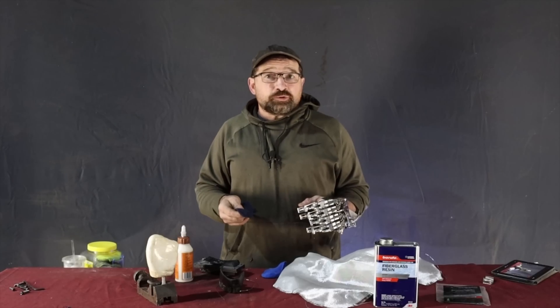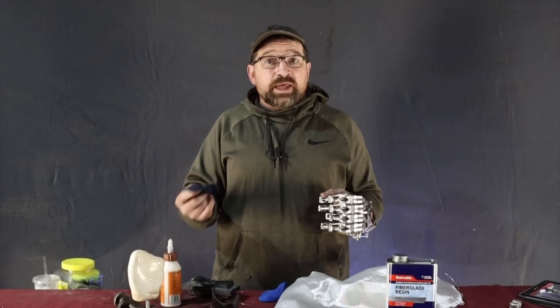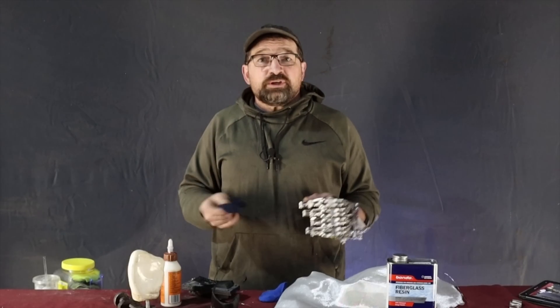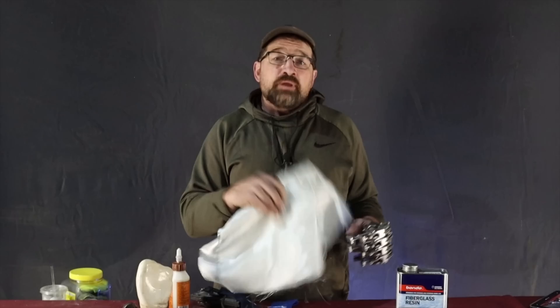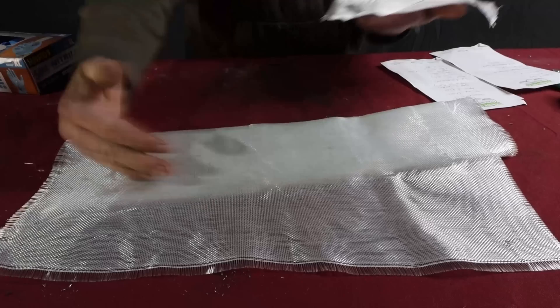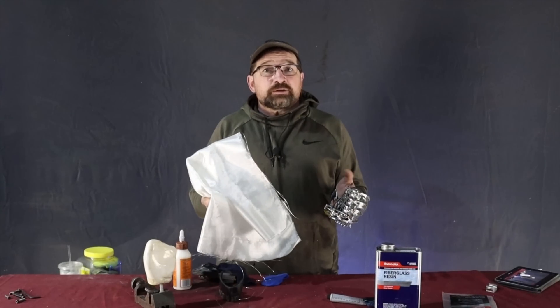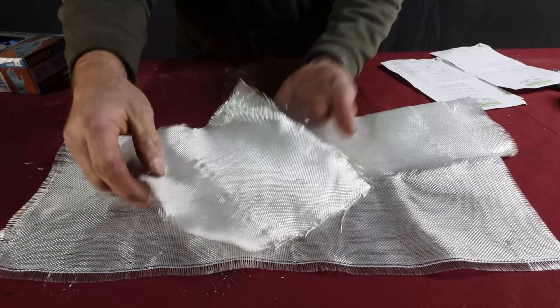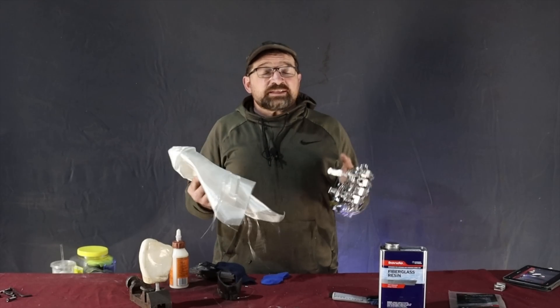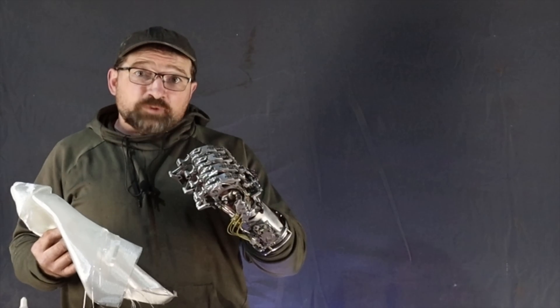You may ask — if socks are so great, why not use them for the entire build? While socks are awesome for conforming to an organic shape, they really don't offer any structural value. That's where the fiberglass reinforcing cloth comes in. Its fibers are woven 90 degrees perpendicular to each other, generating bi-directional strength. If multiple layers are arrayed at 0°, 90°, 45°, and 135°, you can wind up with a composite that has an excellent strength-to-weight ratio.